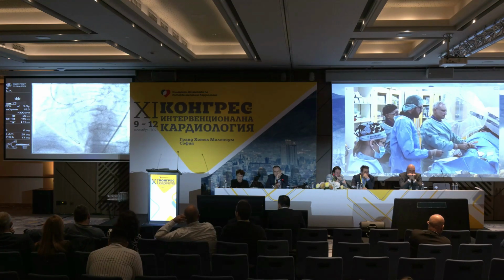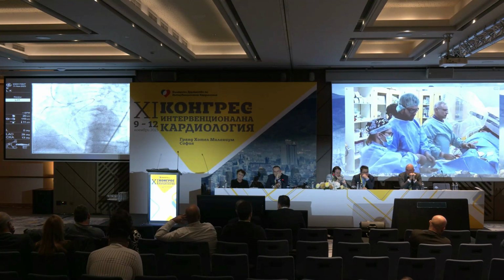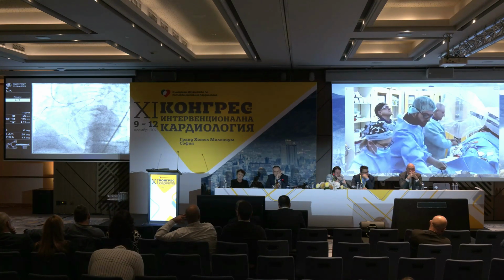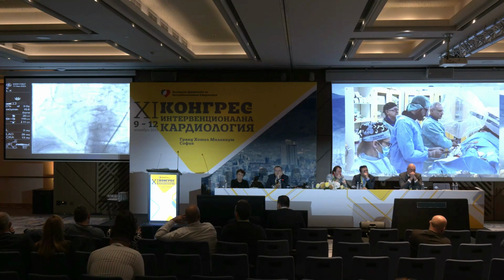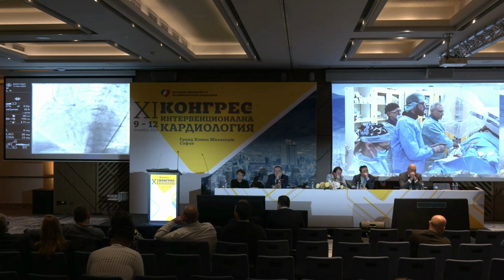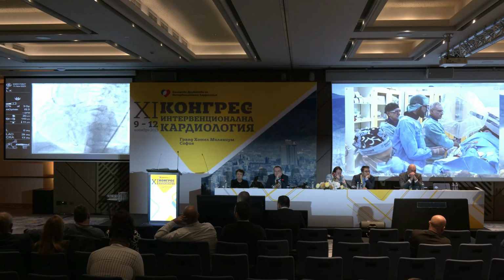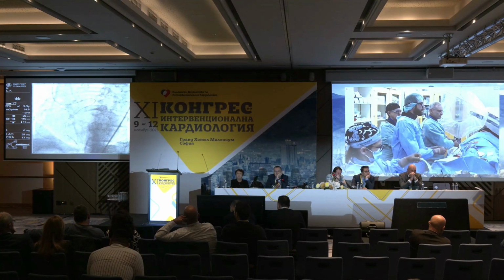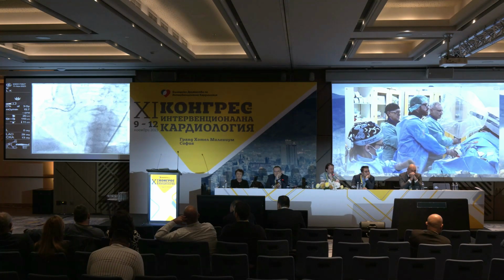That means that we will see how we will make the connection now, because we have to enter the antegrade guide, and usually the antegrade guide is going to the wire. Let me push the amplatz up, if I can. That's better. Or I exit it now. Contrast a little bit. We are okay. Give me the run-through.